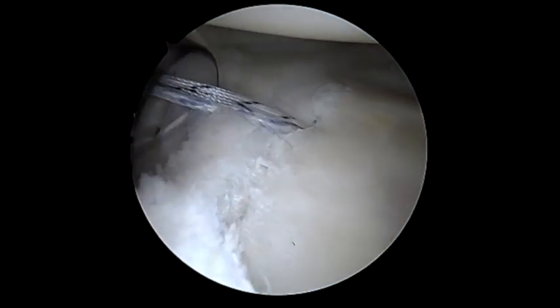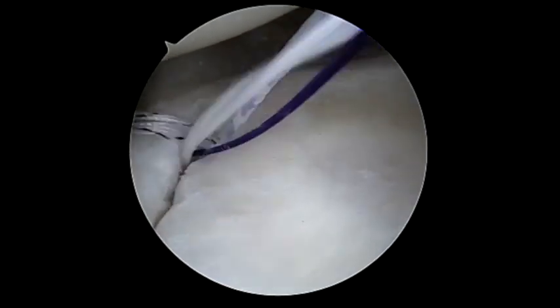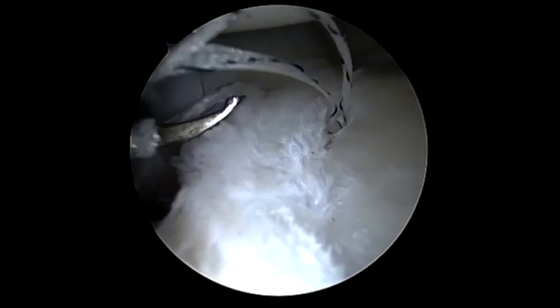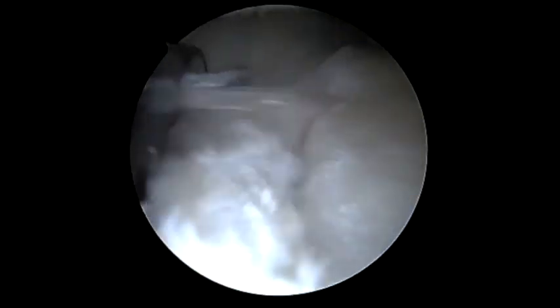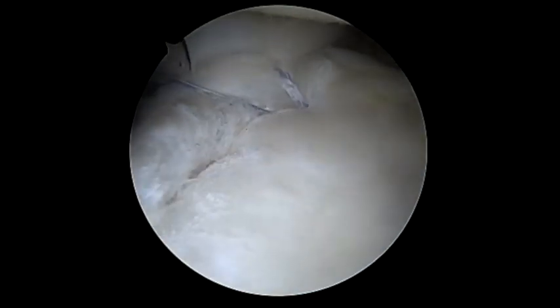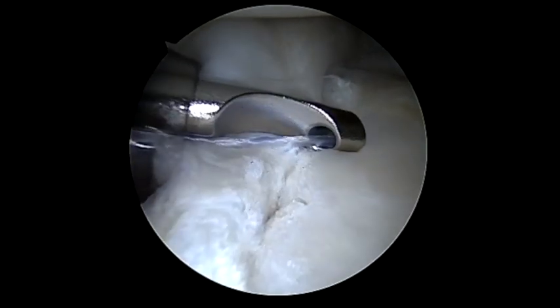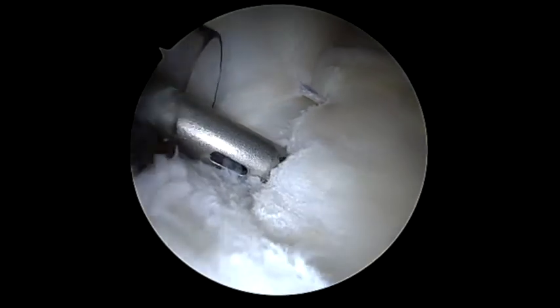We grab the passing suture and use the passer to pass the suture through the labrum at this inferior portion. The key here with all these knotless anchors, as seen in my previous videos, is to remove the loop suture and the blue suture together, as these can tangle and damage the locking function. We're sequentially tightening, taking mostly a labral bite with a very small capsular bite, and then cut that area.